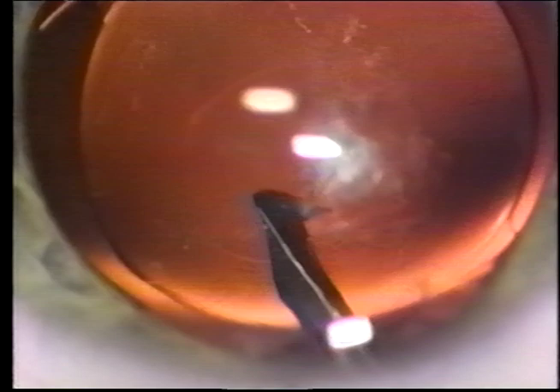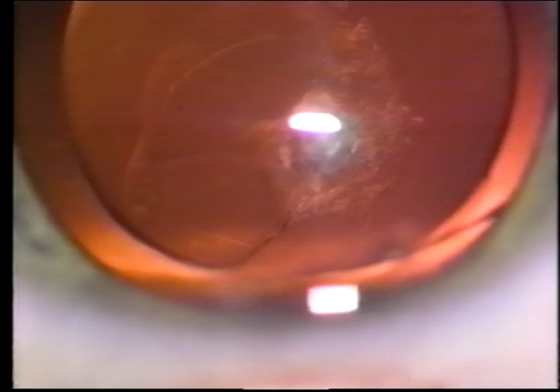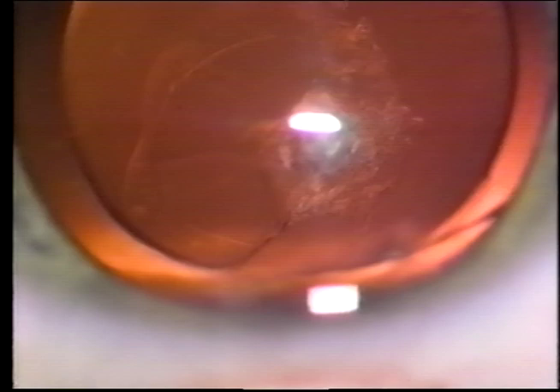Once the flap is elevated to be grasped with the forceps, I use forceps because it is easier to control the tear for the 360 degrees. Additional viscoelastic is added as the tear is extended to protect the vitreous face. One must be careful not to inject too much viscoelastic because the tear can be extended in an undesired direction with the force of the viscoelastic.